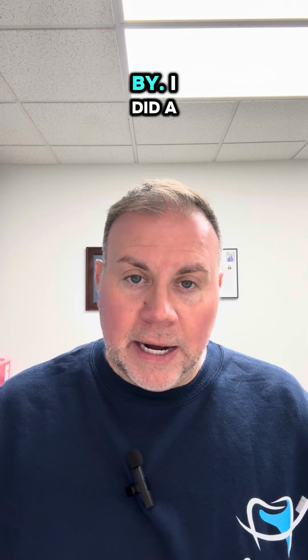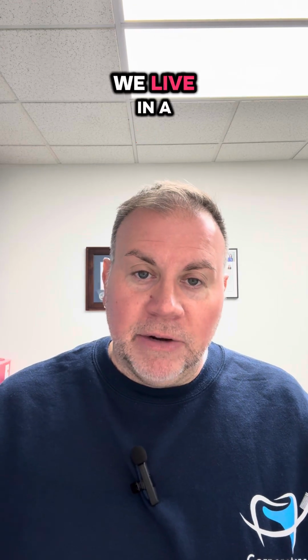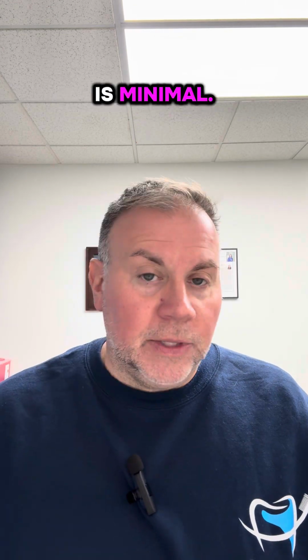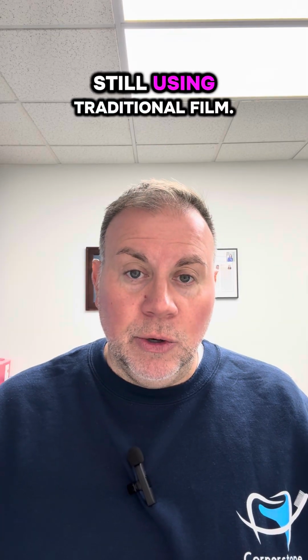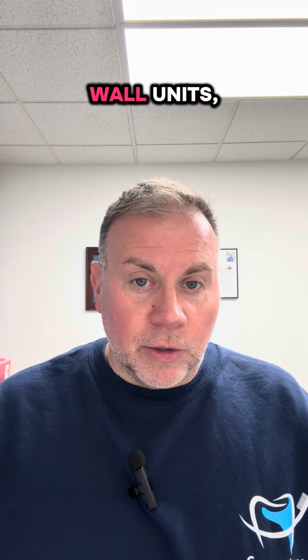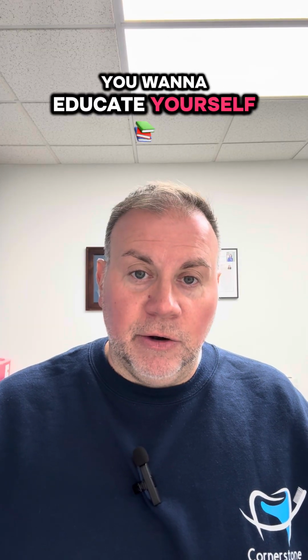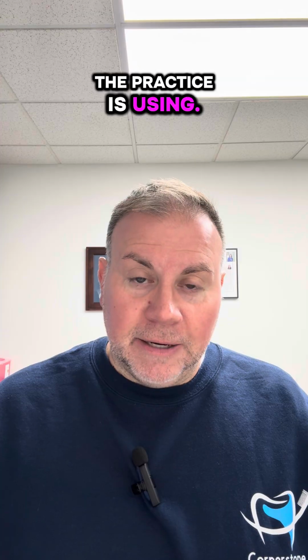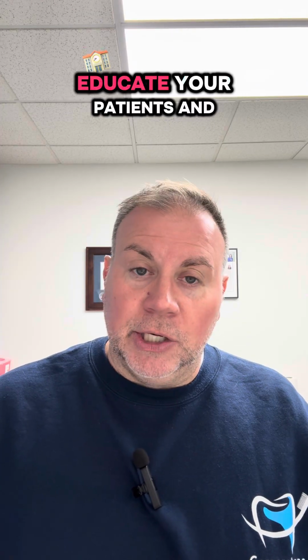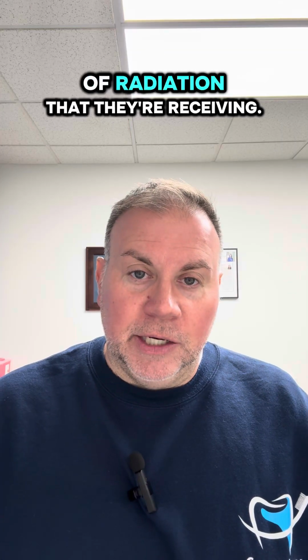And don't just go by, I did a video a little bit ago about radiation. Don't just go by, hey, we live in a day and age where radiation is minimal. That's not the case. 13% of practices are still using traditional film. And on top of that, there's a lot of practices still using wall units. So that radiation is more out of the wall unit than a handheld unit. So, you as a patient, you want to educate yourself as far as what the practice is using. And then also dental staff members, educate your patients and let them know what you're using and the equivalent of radiation that they're receiving. So I hope this helps for today.